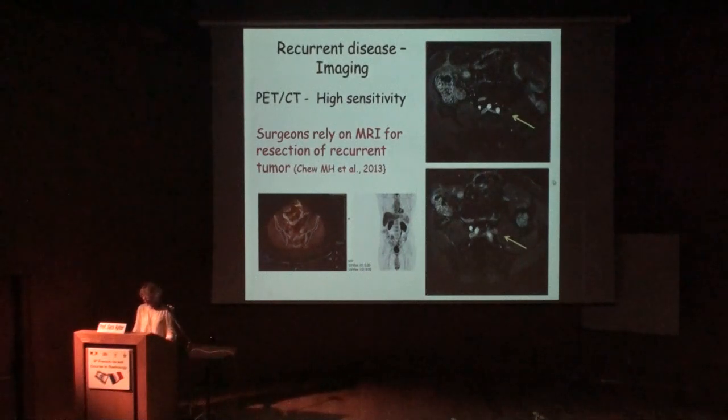So one can see that it helps us, if we see both studies, to really see where the metastases are. Although it has been said that the prognosis of patients with hydronephrosis after rectal cancer is bad, the surgeon went in and operated on this patient because he wanted to relieve him from all these small deposits of cancer.